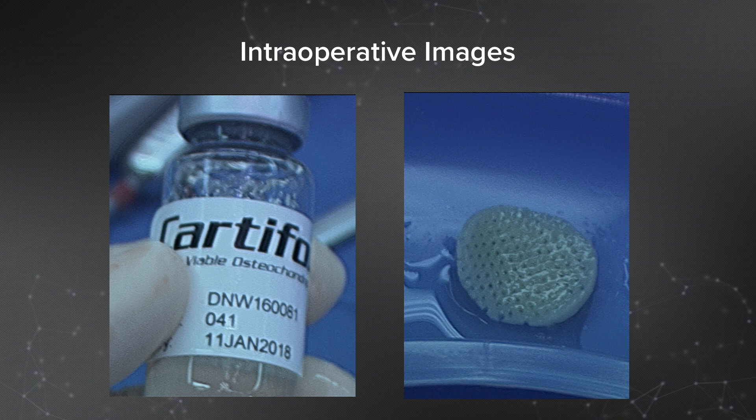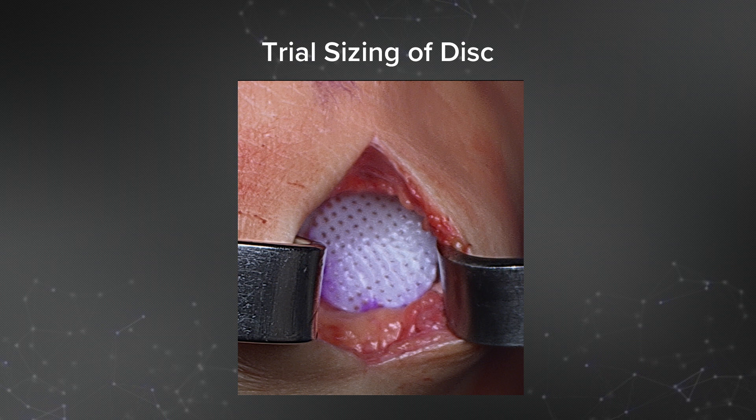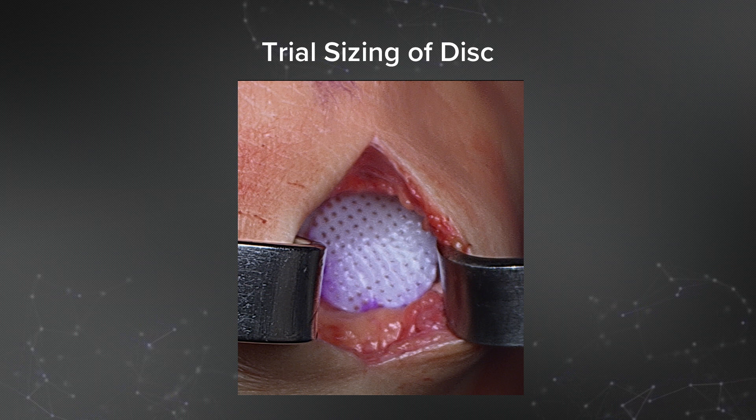Here's the actual Cartiform. It comes frozen and takes about five minutes to thaw. On the back table it's very thick and durable — it has a bony layer and is very strong. We then go to trial-size the disc. One way is to trace out the disc size on a sterile piece of paper, place it in the lesion, whittle it down, and then cut the Cartiform disc down to size. I typically just place the Cartiform disc directly in the lesion and whittle it down to size.